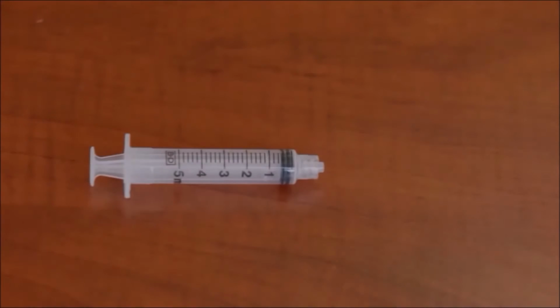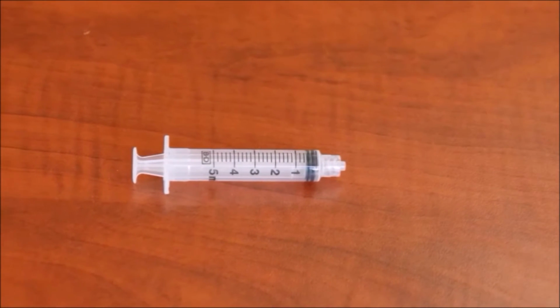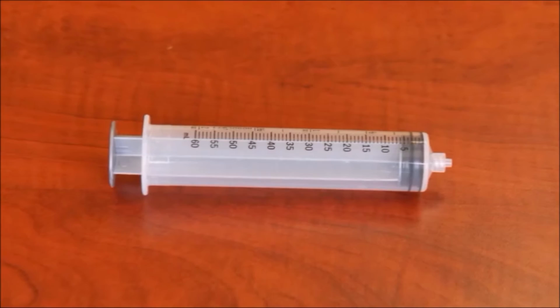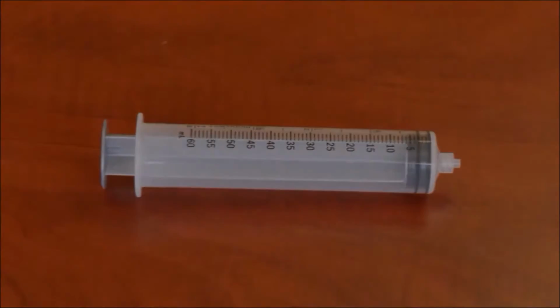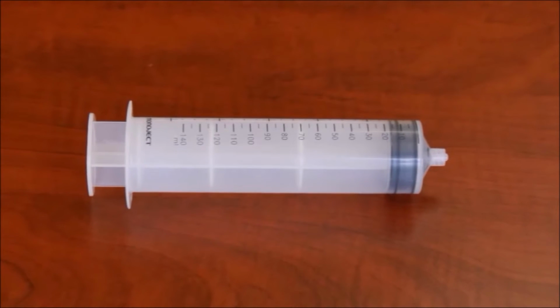The 5cc syringe is specifically designed for priming the sphincter balloon or balloons. We have a few options of syringe sizes for administering air into the rectal balloon. You can use either a 60cc syringe or a larger 140cc syringe.